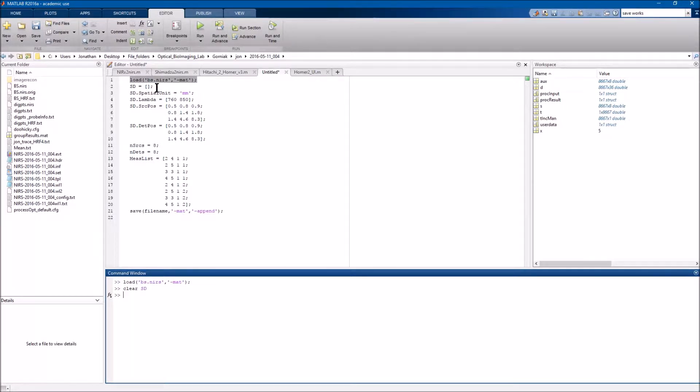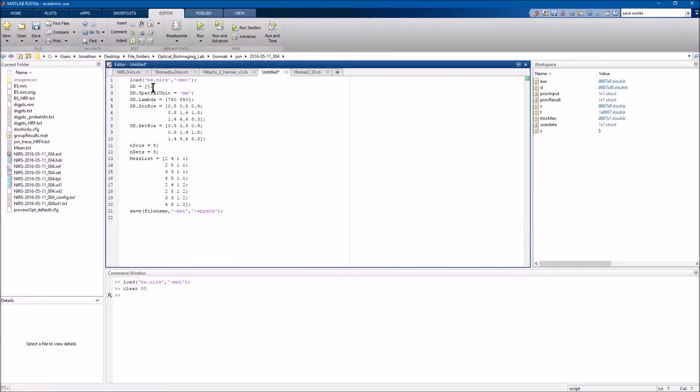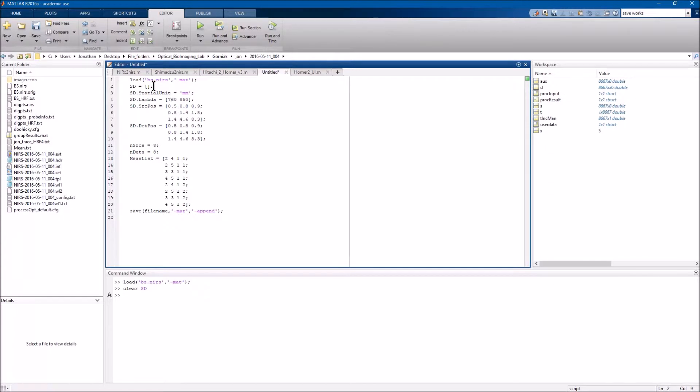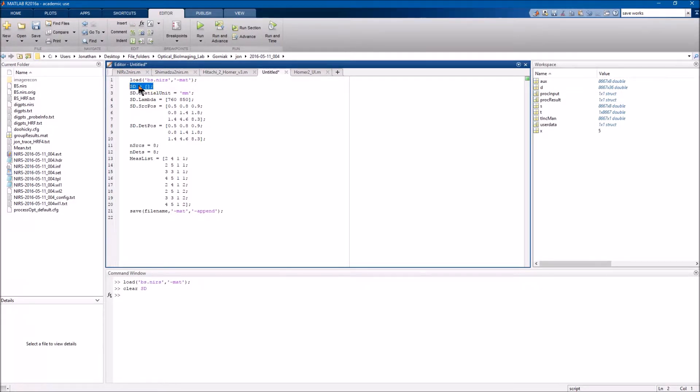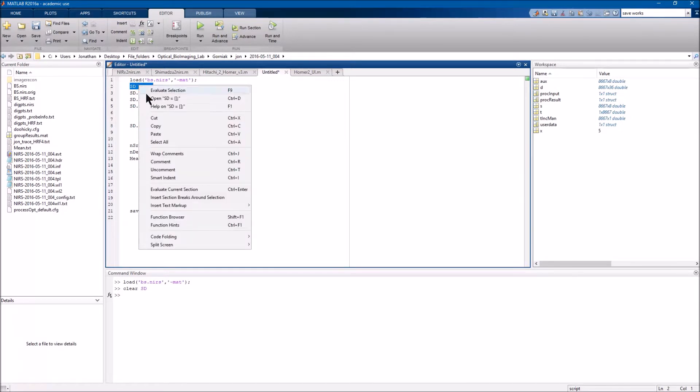So now what I'm going to do is step by step kind of show you how you can create it on your own in MATLAB and then actually append it to your file. All this said you could actually include this in your conversion script itself so that you wouldn't have to do this, but if you've already converted the data and you need it in there, this will help you do that. So first I'm just going to create an empty variable called SD.